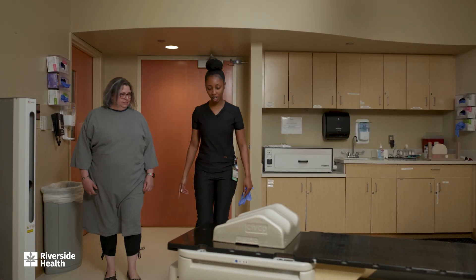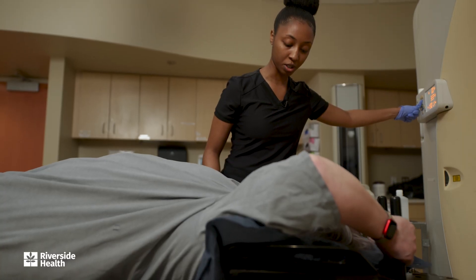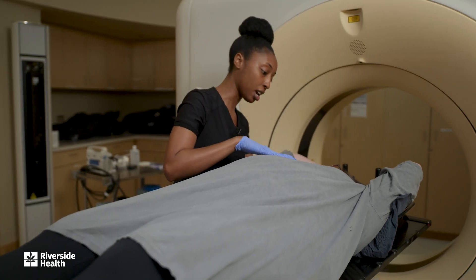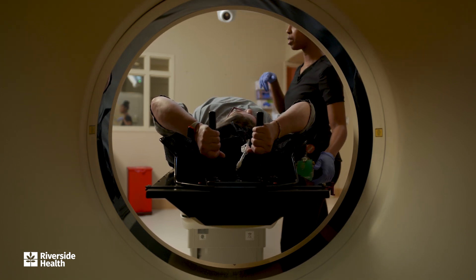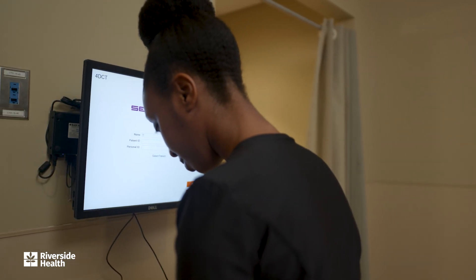I want you to come around to this side and have a seat. When you come in for your simulation, that's going to be the first part in the treatment planning process. The name of the game in radiation therapy is reproducibility. This room is all about creating a position that is reproducible and allows us to set you up the same way every time you come. We use a lighting coaching system in order to help you get the best breath hold and to reproduce the breath hold that we will be using to plan your treatments with.